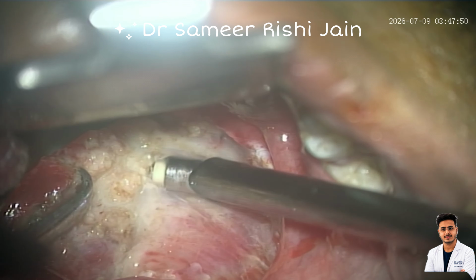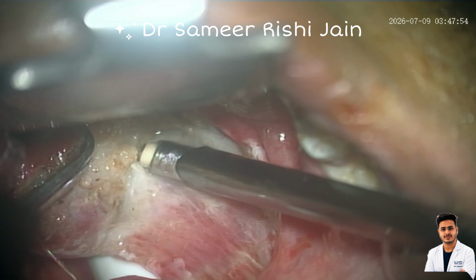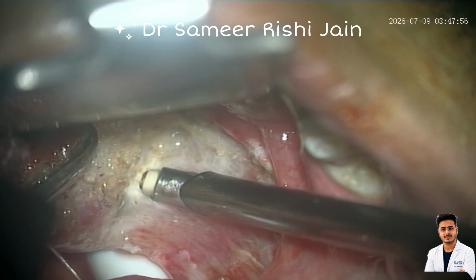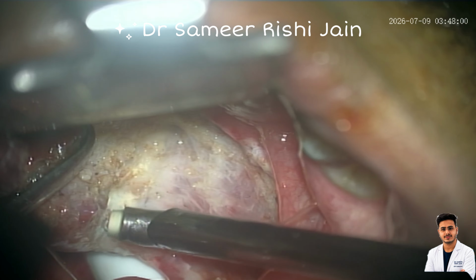The little bit of the oozing can be stopped using the coagulation. And as you can see, the tissue is a little firmly adherent and I have to do a little more of the ablation at the lower end.